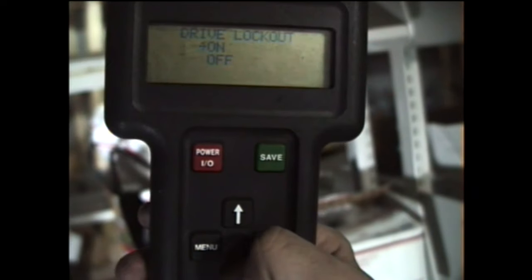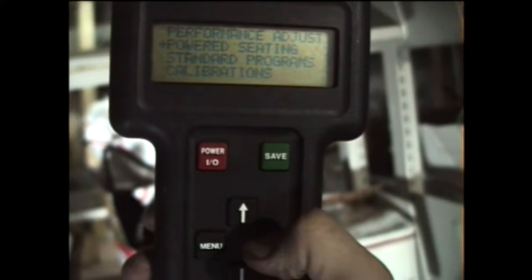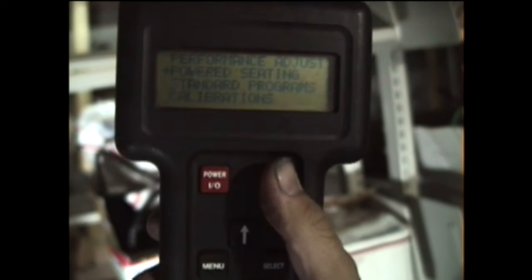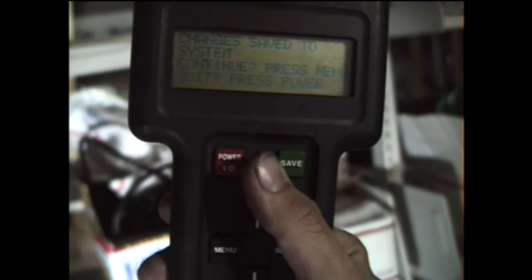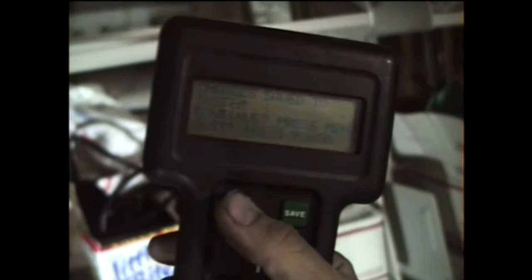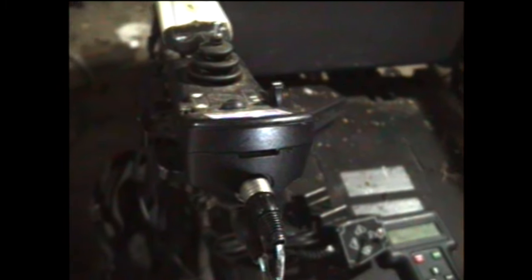Turn it to Off, press Select, then go to Save and press Save again. Then press Power. After you press Power it will be turned off — the Drive Lockout is off.